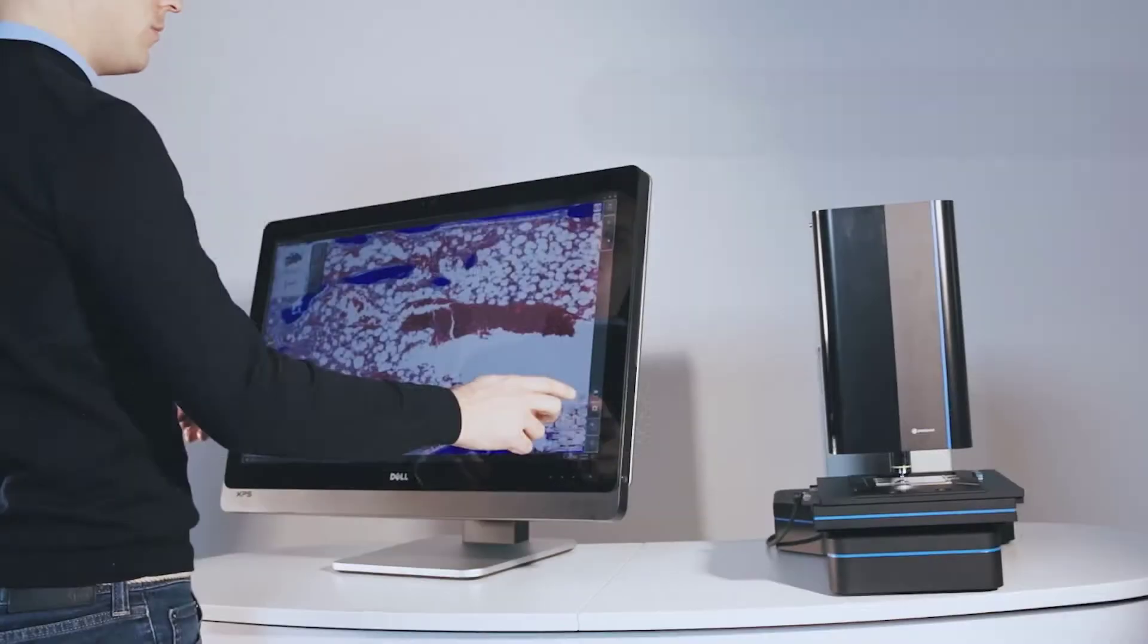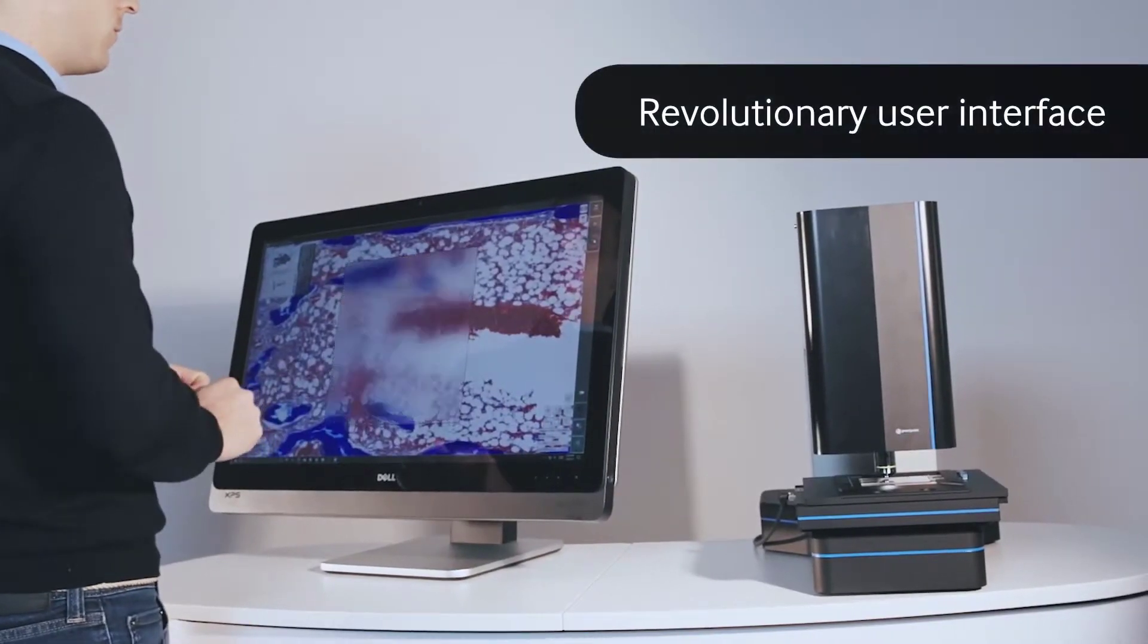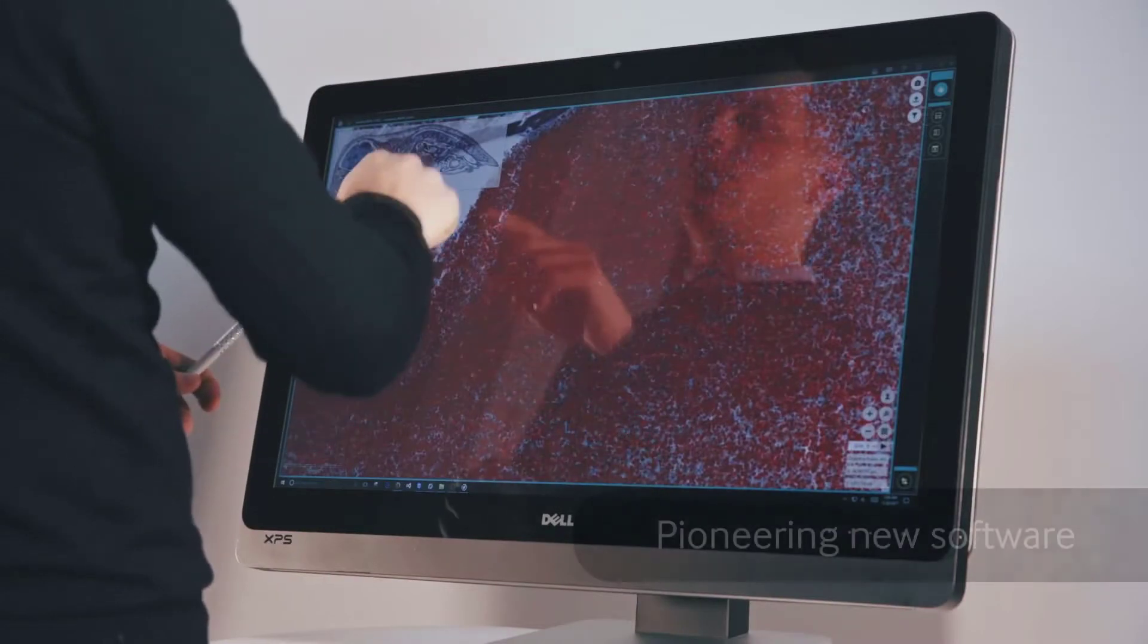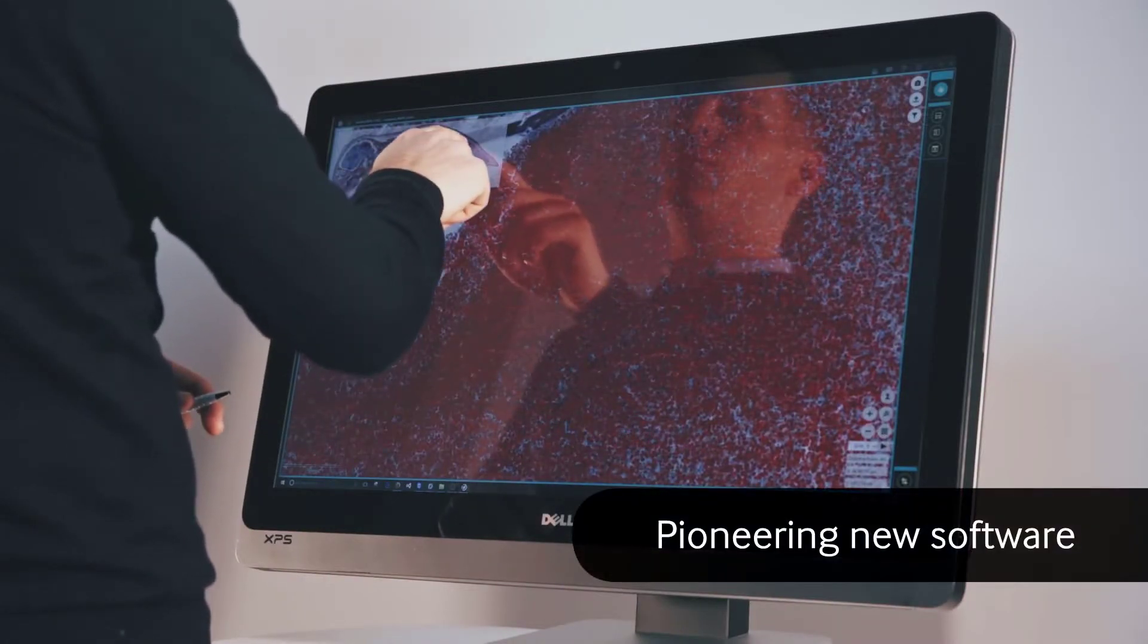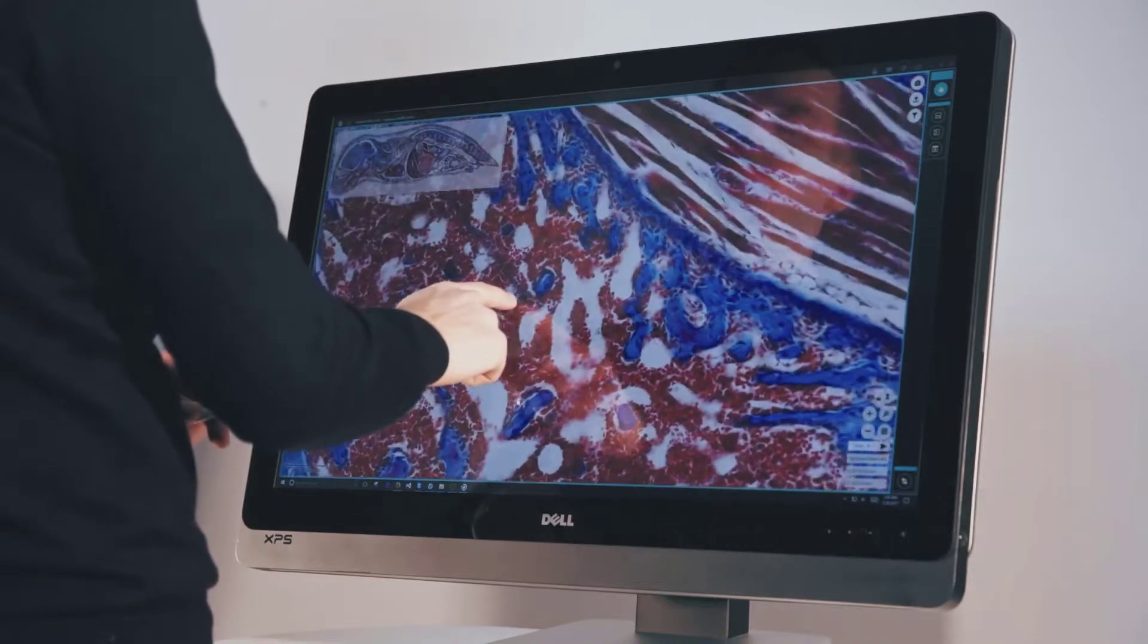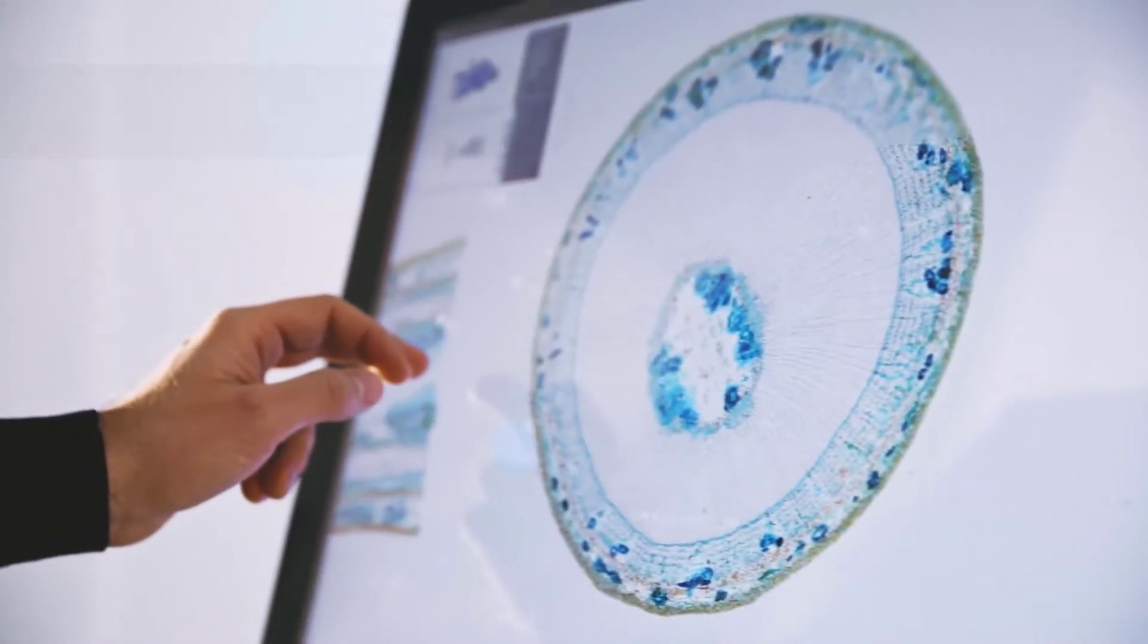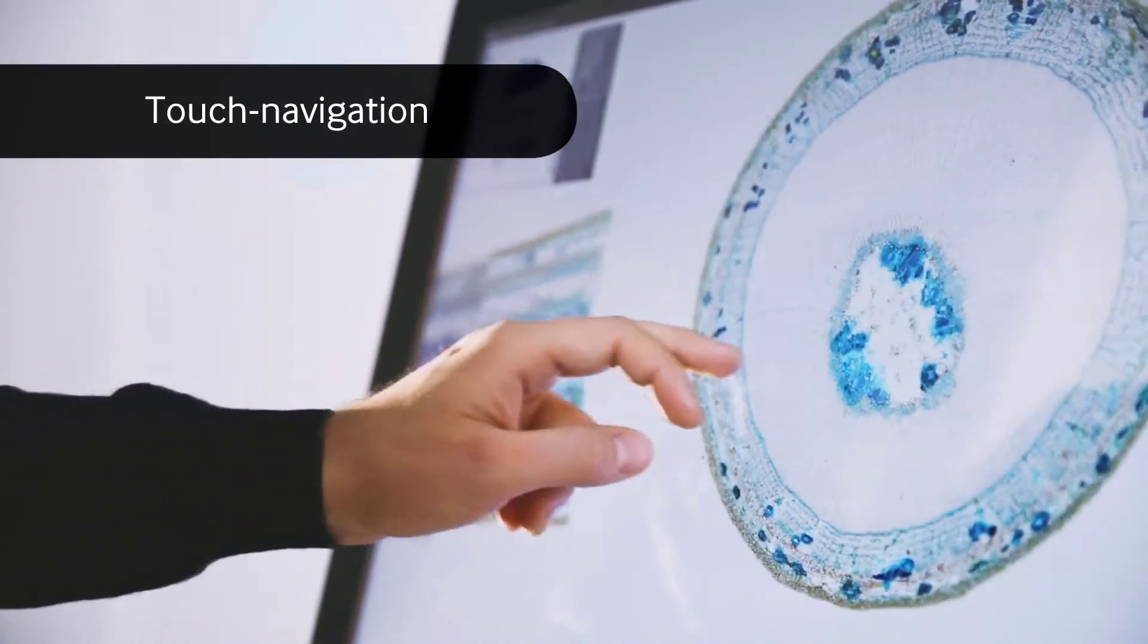A revolutionary user interface enables a revolutionary product. PressiPoint introduces an entirely new user interface based on large multi-touch display and easy-to-use software.